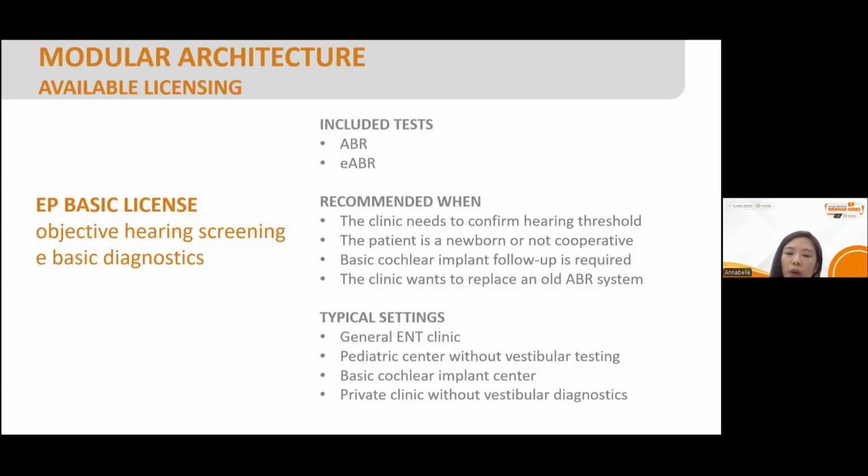So I think the ABR is quite good, yeah. And also the EABR we talk about in a cochlear implant operation, in the operation theater, in the middle of the surgery, we'd like to know after the insertion of the electrode whether the electrode was inserted successfully, then we go for the EABR, it checks the impedance.